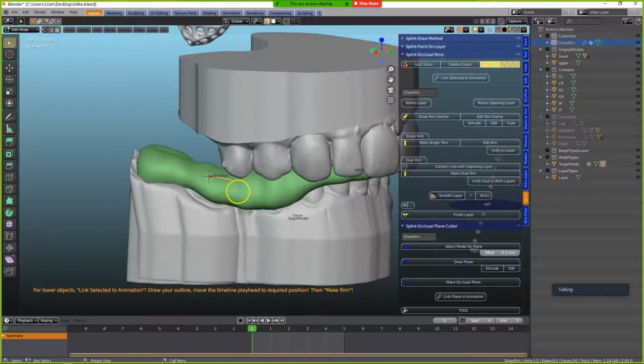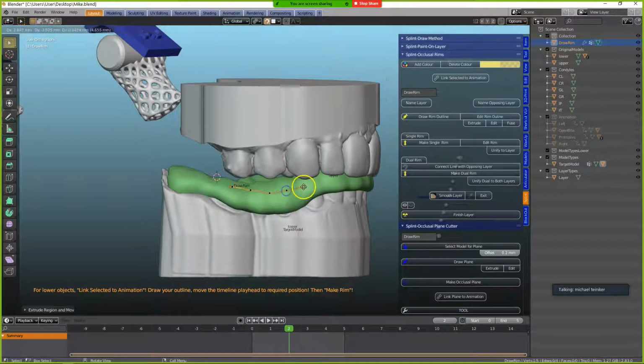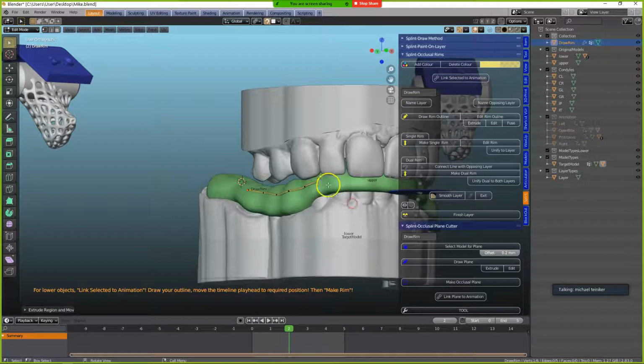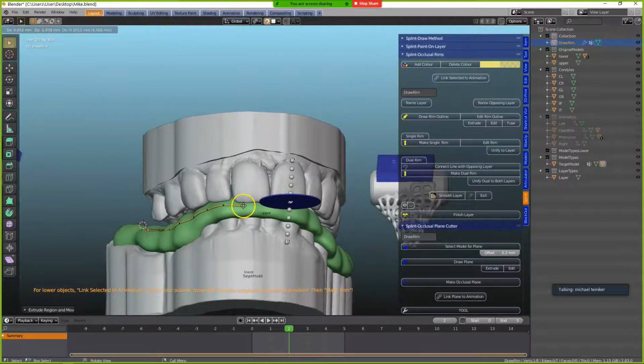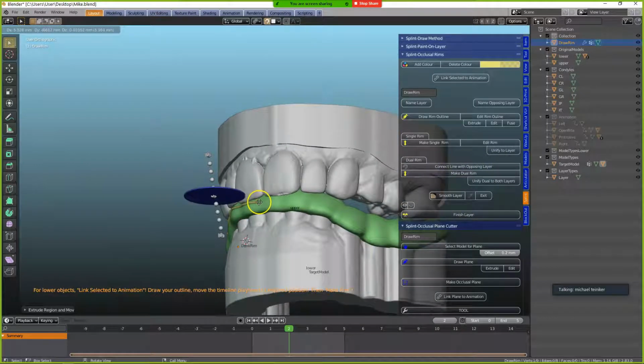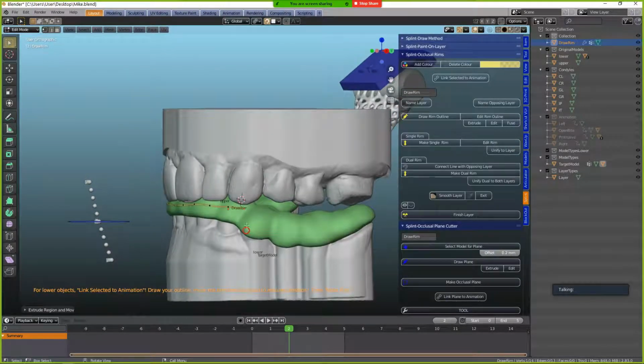Then we're going to extrude it, and I'm going to put it like this somewhere, okay, and we're going to extrude this outwards. Now we don't have much space there, but hopefully our articulator is going to get rid of some material. So here we're going to go all the way.